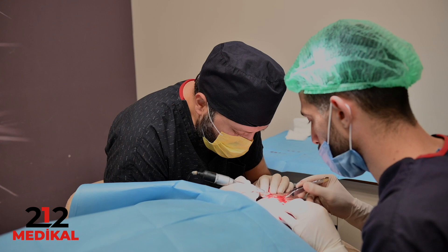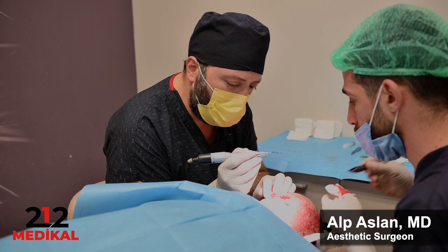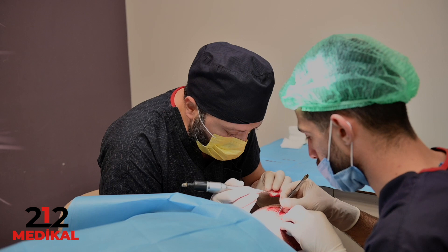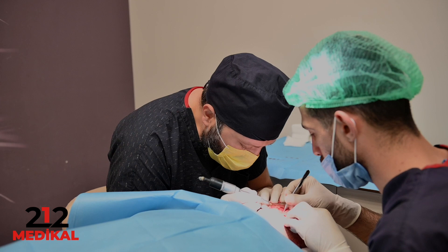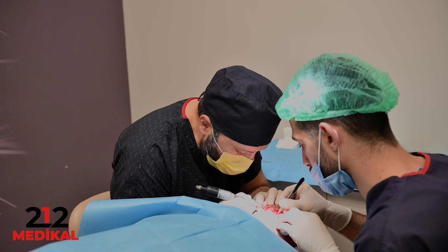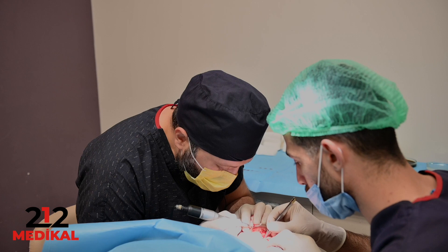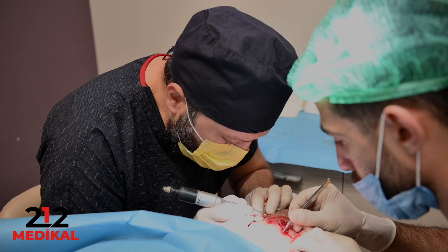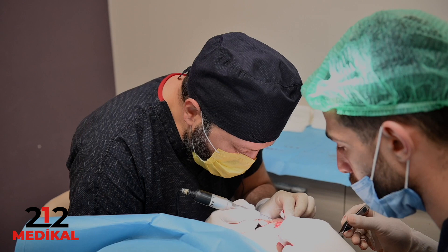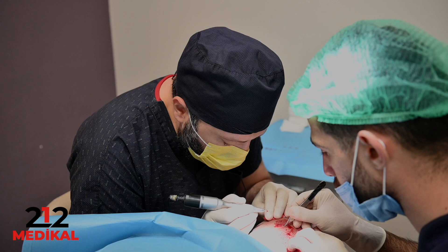The micro FUE technique has three steps. The first step is extracting the grafts with a punch. I use three different punches — a gold one, a standard metal punch — and the most important part during extraction is the sharpness. I prefer the sharp punch because when I use it, the risk of graft damage is lower than with other punches. The decision on punch diameter is also very important.